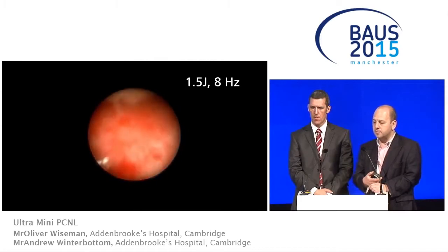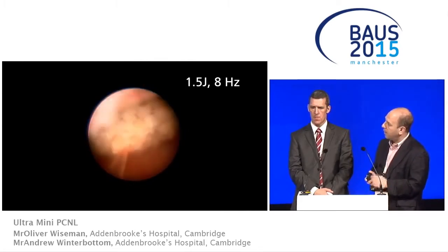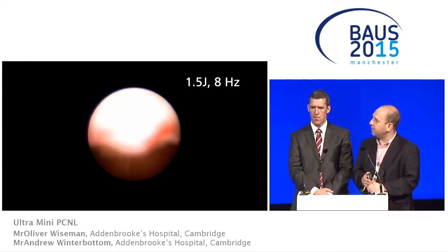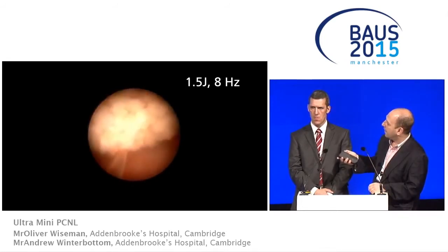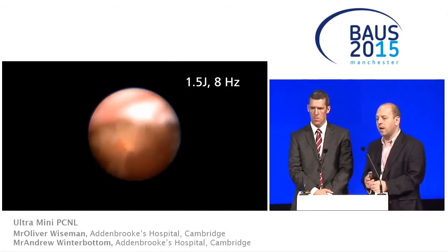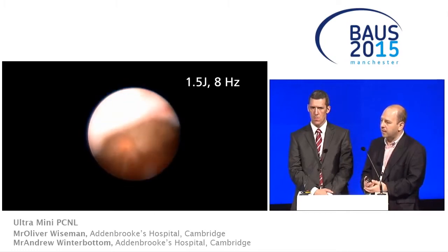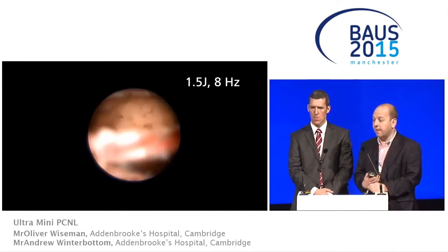flush out. It was quite hard to access the stone when it was wedged in the infundibulum, and we've just nudged it now into the renal pelvis. So you can see we've got a relatively good view of it here. The upper part of the neck of that calyx is just in the way a little bit, but we'll start to fragment the stone into, as I say, 2 to 3 millimeter fragments, and then wash those out using the Venturi effect. And also we flush up from below through the ureteric catheter.